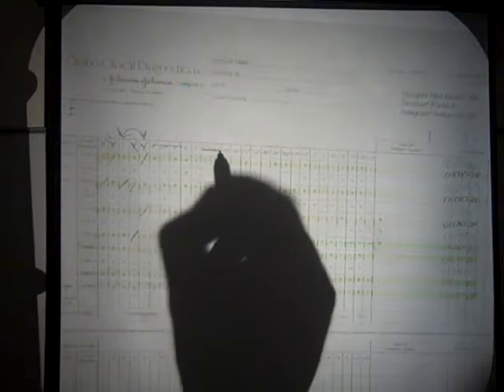Let's look at little e. Cell line number 1 will work, as will cell line number 5, so we have ruled out little e. For now, please disregard F, CW, and V. Disregard KPA through JSB. So let's move on to KEL. This is kind of our rule breaker. Remember, we can have 3 heterozygous combinations to rule out big K.